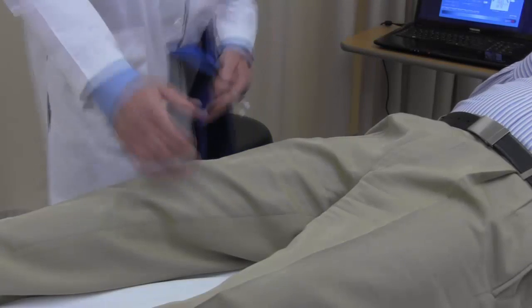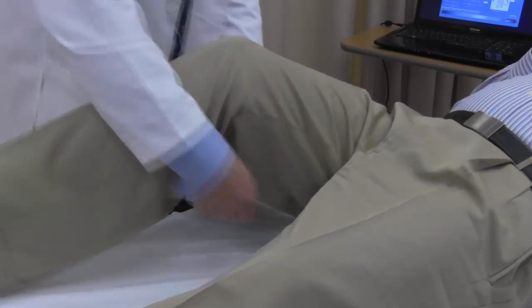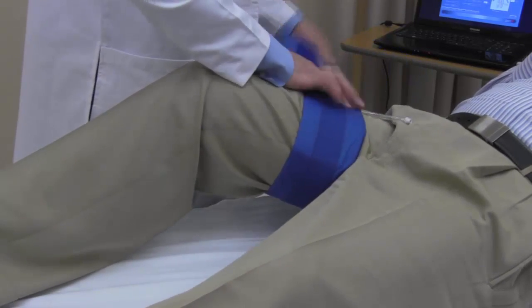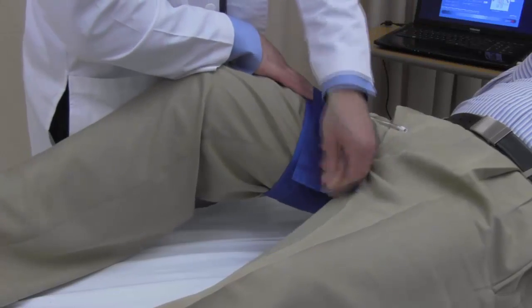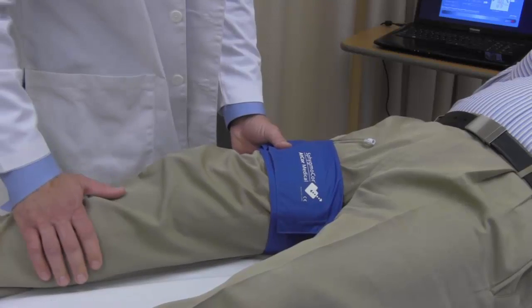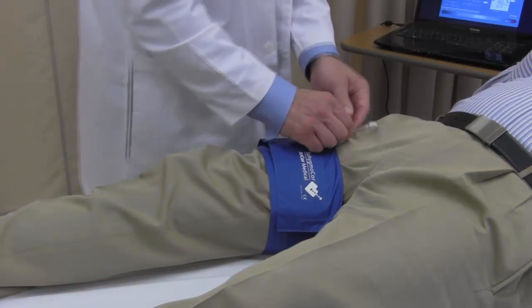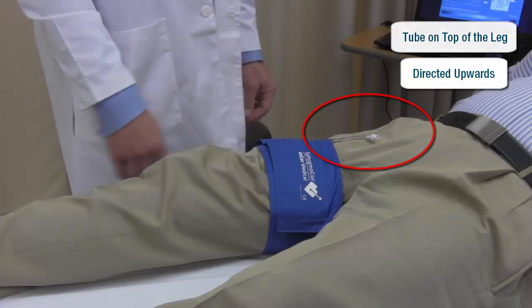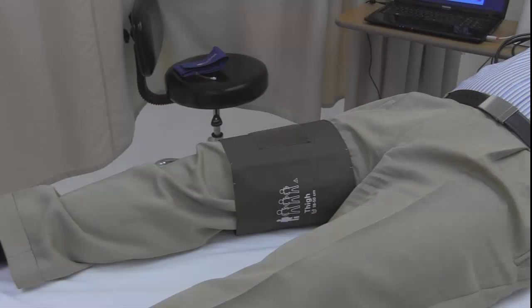For further information about the larger thigh cuff, please contact your Atcor Medical sales representative. Place the thigh cuff on the patient's leg as far up on the thigh as possible. The cuff can be placed over thin clothing, but in some instances it may be necessary for the cuff to be in direct contact with the patient's skin. Ensure that the tubing is on the top of the leg and directed upwards towards the patient's core. Proper cuff application is important for ensuring high-quality data capture.